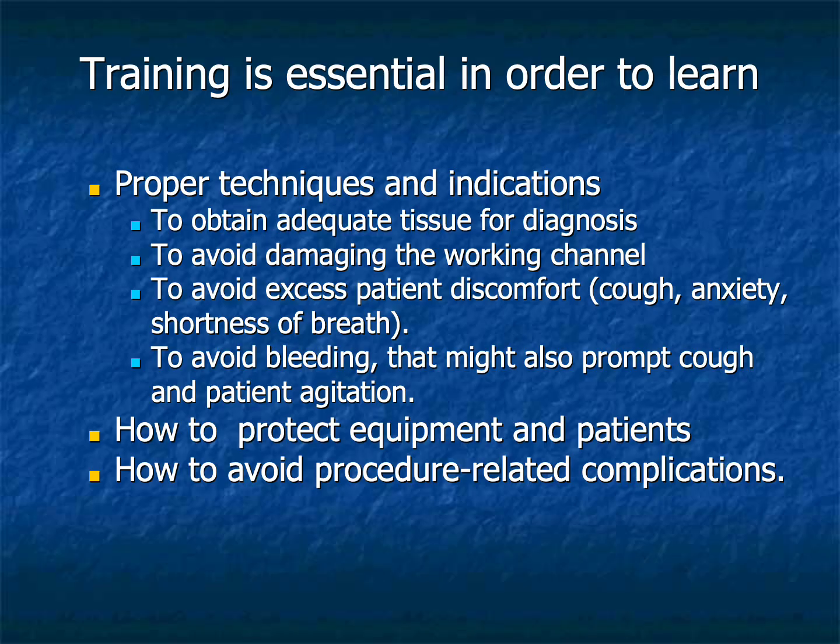Good training seeks several goals simultaneously: obtaining good diagnostic material, avoiding patient discomfort, preventing bleeding, and protecting the equipment. We also must reduce complications, and most importantly, we must learn to balance procedural ambitions with procedural restraint. Competence often emerges through attention to details that initially seem small.